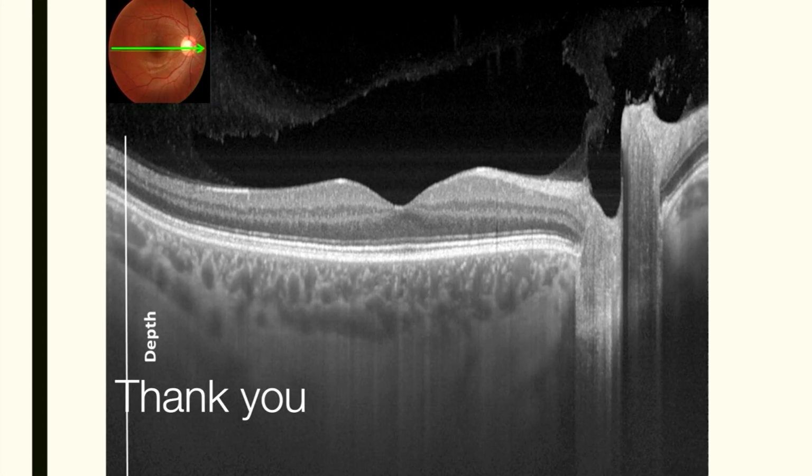So optic nerve head, as I mentioned, there are radial plexus which is there peripherally. In fact, now the newer studies are that there is thinning of this plexus in patients with primary open-angle glaucoma, and they believe that it is the ischemia which is causing the thinning of your lamina cribrosa, which is why it is becoming deep cups and all those things. So there are studies where they are studying this area in and around the radial peripapillary network in glaucoma also.